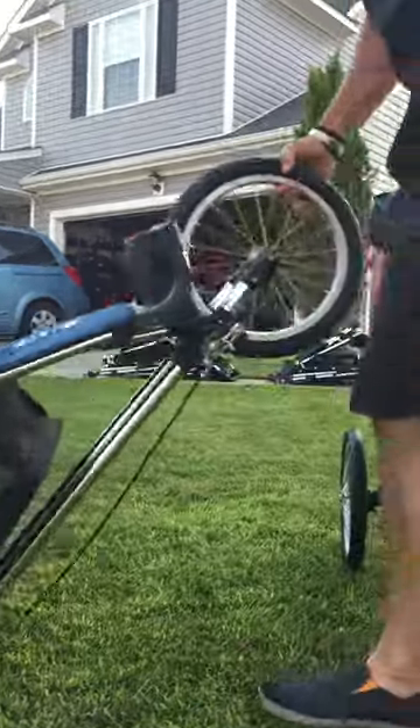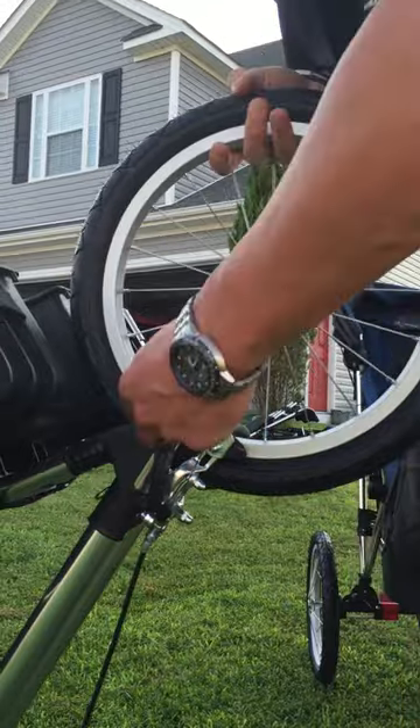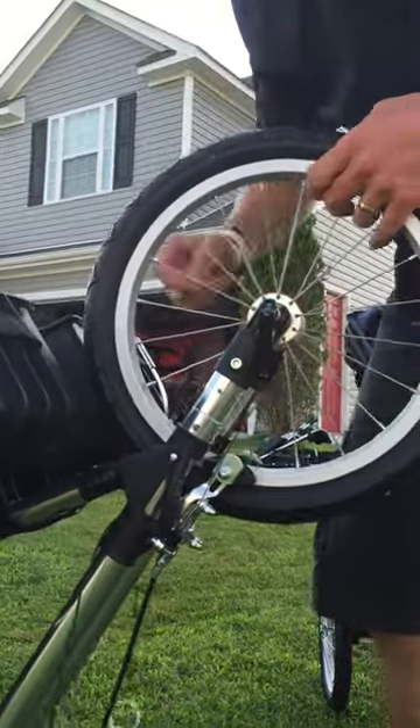Then you come to the top, to the front. The front is pretty straightforward — you've got a quick release one, quick release two, pull the pin, pull the pin, and then the tire comes out the front.